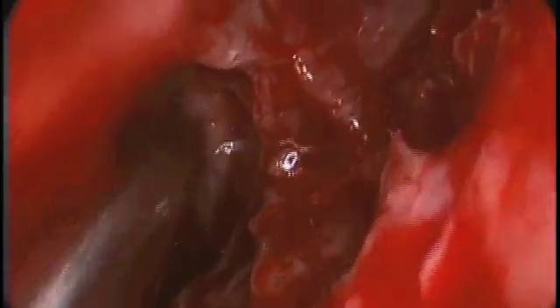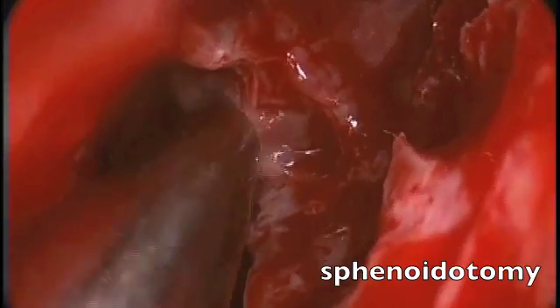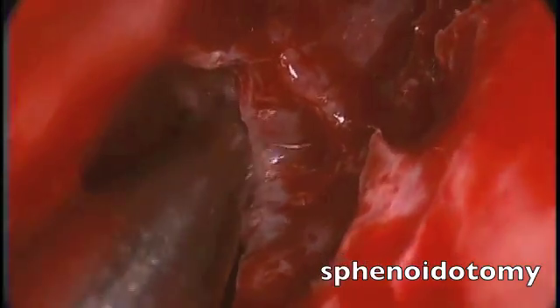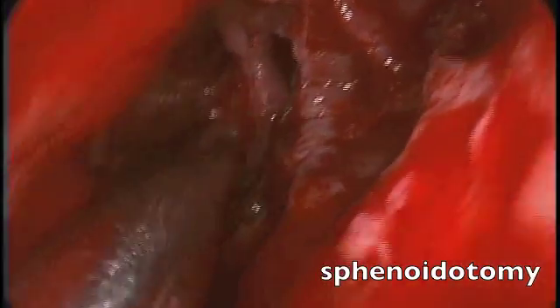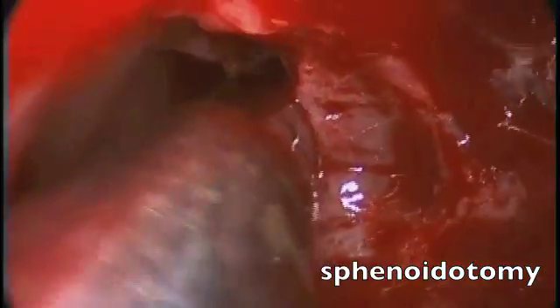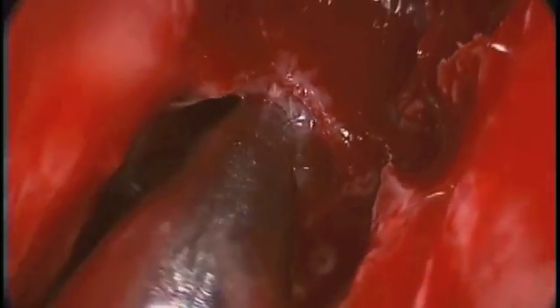The scope has now actually been dropped below the patient's residual middle turbinate as they have had some partial resection. We are now in their sphenoethmoidal recess looking at the region of the patient's sphenoid outflow, which we are widening with the microdebrider to maximize the sphenoid opening.